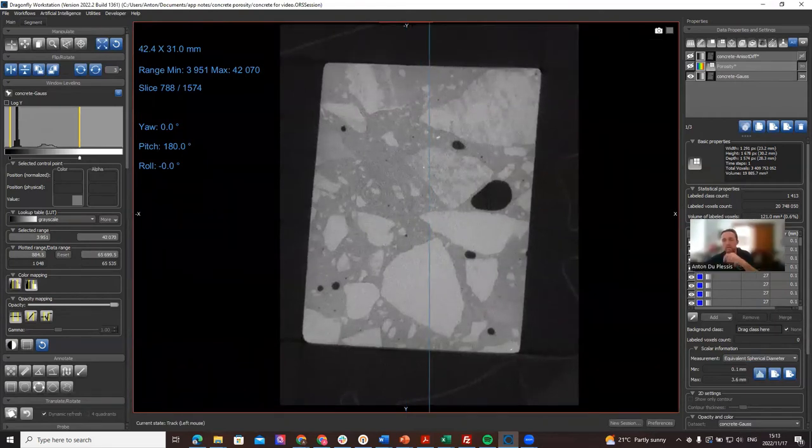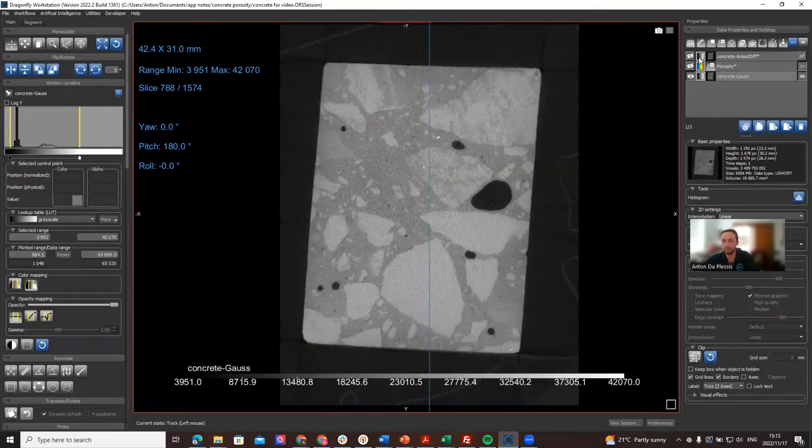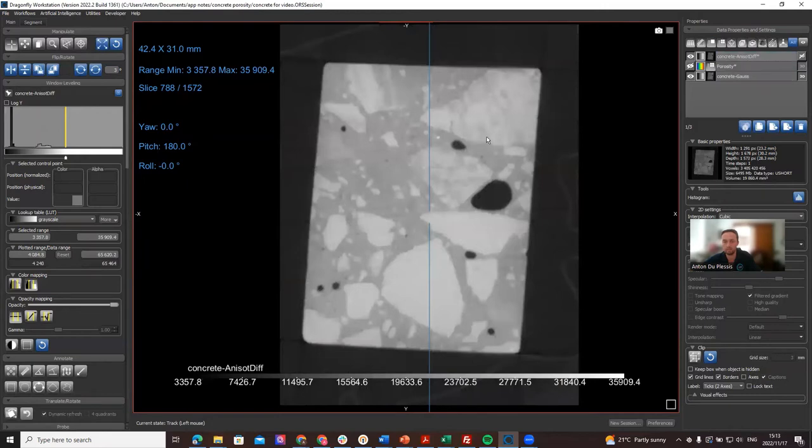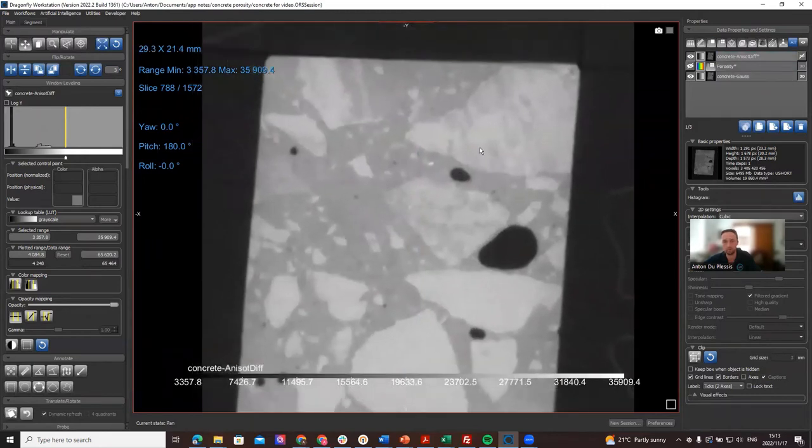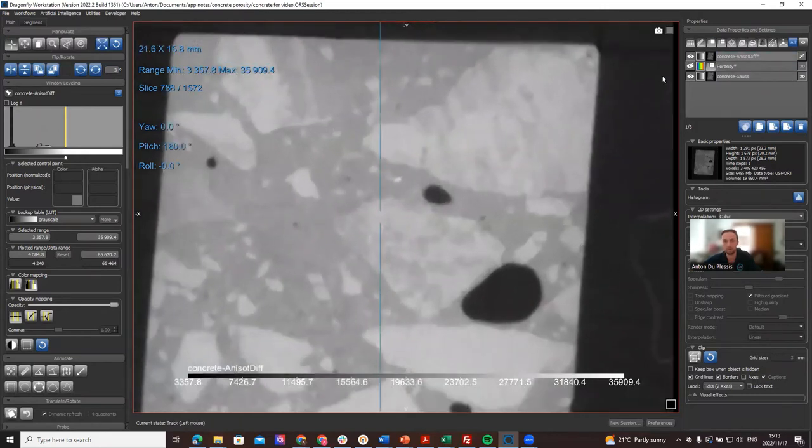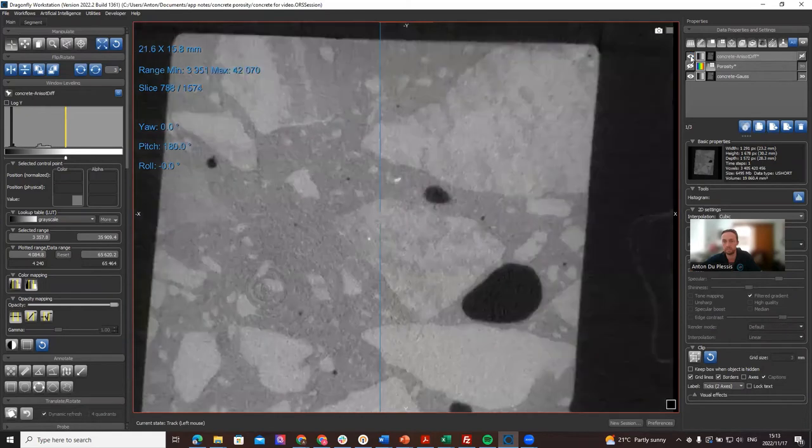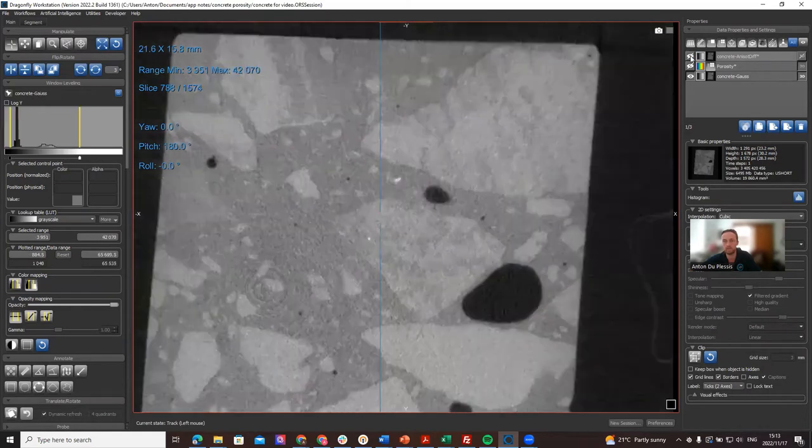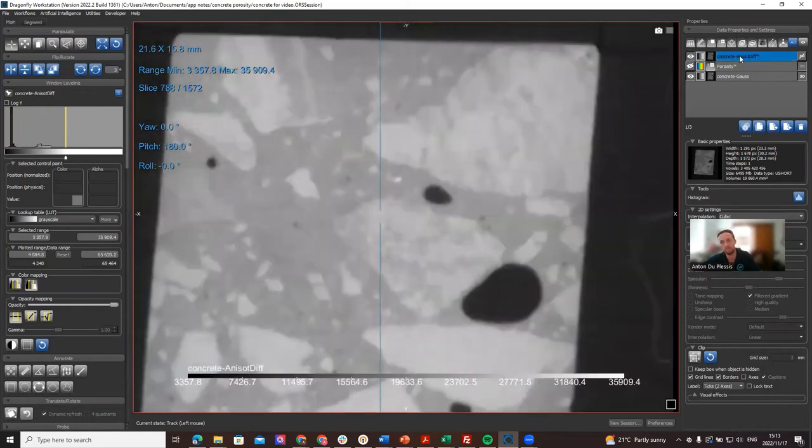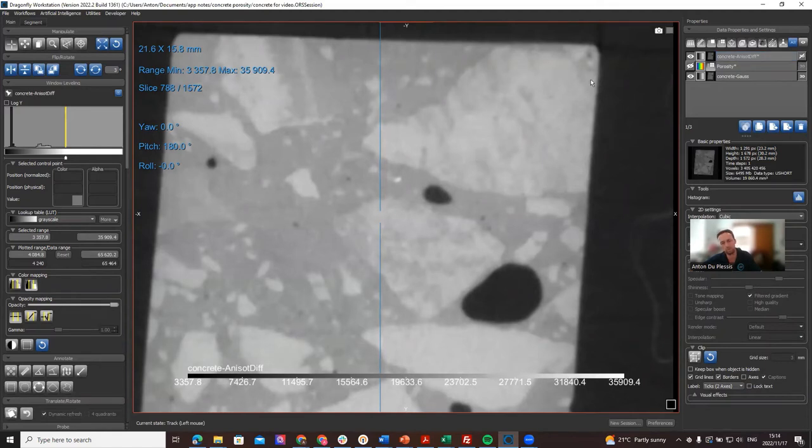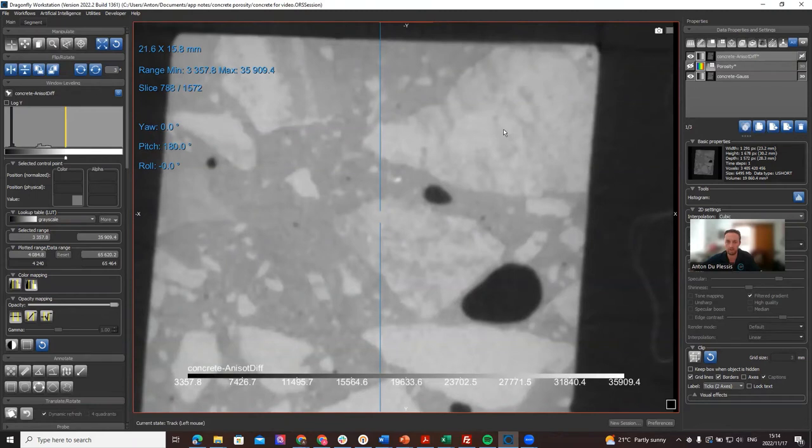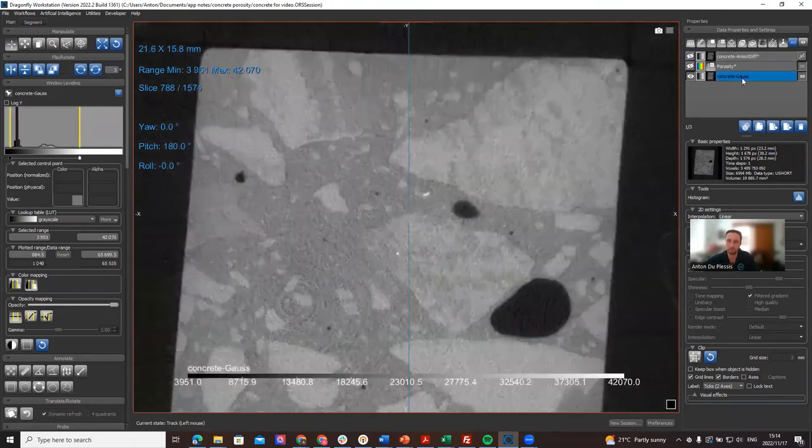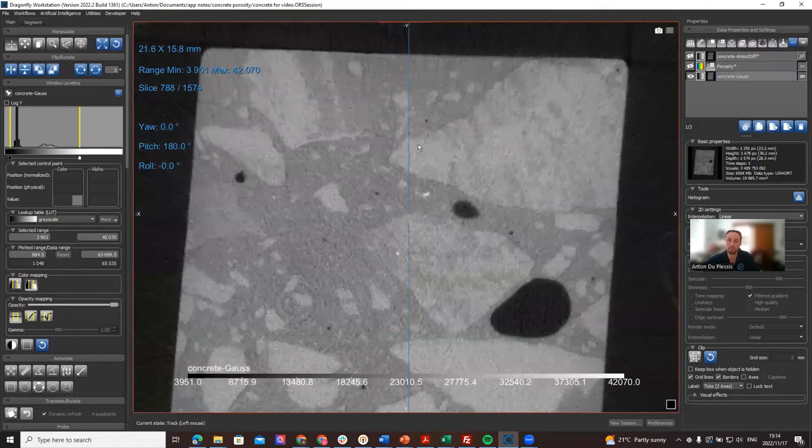What I've done here is I've used the image filtering toolbox to make a blurred out version, so you can see that when I toggle between these two datasets, the one on the top of the list here is much more blurred out and the edges are not so clearly defined. So how do we quantify that? We can use image quality metrics which work on 2D image slices. Let me show you how that works and how to get to that.